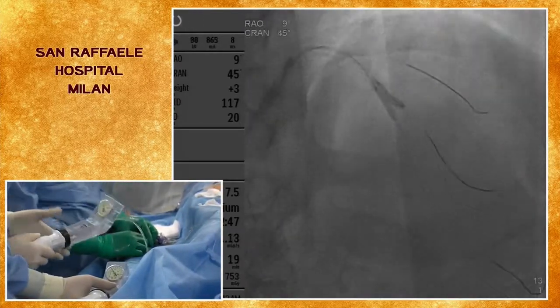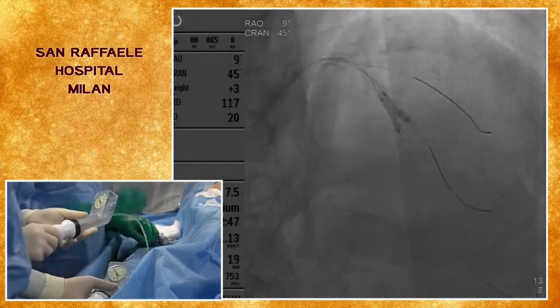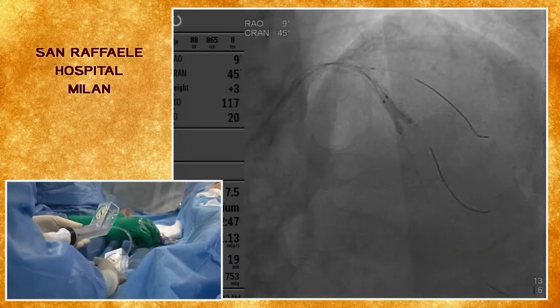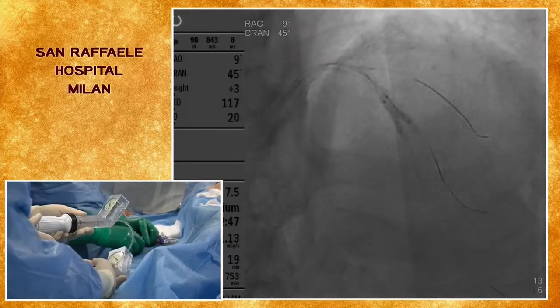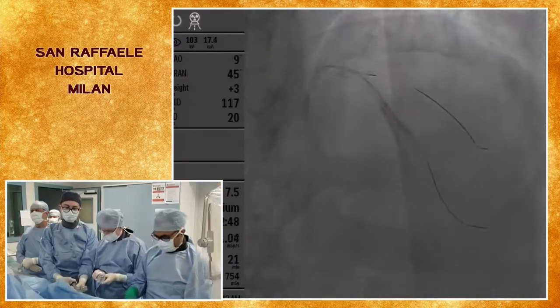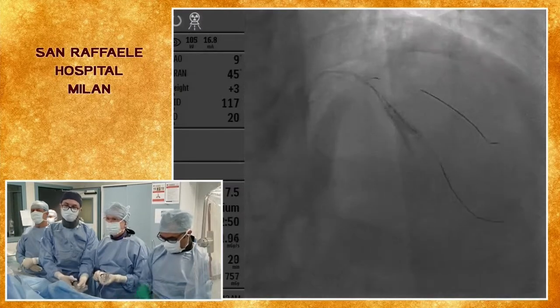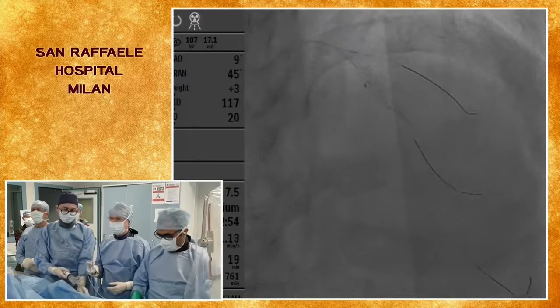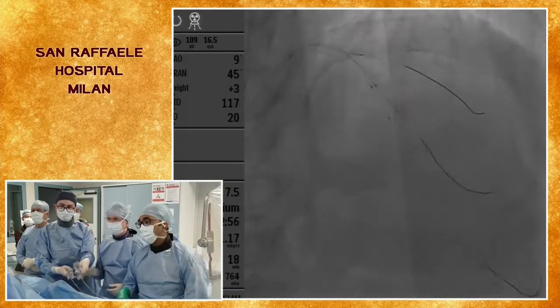And this is basically already a POT. Yeah, it's a little bit oval, but it's a POT. And the POT done after. Yeah, usually you do the POT before, but it's okay. So we are at 11 with both. Okay, deflate both. We can take out the balloons, take a nice picture.